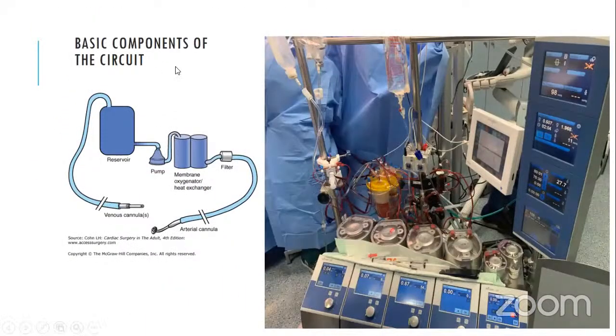As a basic component, we have a venous cannula, which is draining blood from the right side of the heart to a venous reservoir. Then the blood goes through the pump to the membrane oxygenator and heat exchanger, where gas and temperature exchange. Then it goes through an arterial filter, where micro bubble filtering can be done, then through the arterial cannula to the systemic circulation.